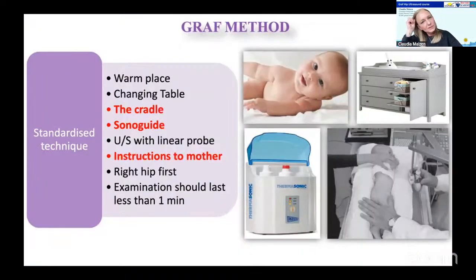To describe those methods a bit more in detail, so we can understand the pros and cons of these methods: the Graf method, as we heard in a lot of detail already, is very, very standardized. Not just how to analyze the picture in a standard plane, but also the screening process. We have a cradle and a sono guide, which are recommended to produce standardized pictures, but there are also great guidelines on how to set up your examination room and what instructions to give to the mother.